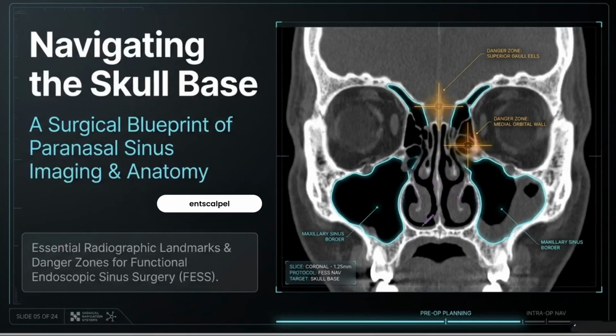Precisely. It's not about the destination of the image. It's about dictating the physical path of the radiation to ensure absolute consistency. Because if that beam is off by even a few degrees, the shadows overlap completely differently, right? Exactly. A shadow might obscure a real pathology, or honestly worse, it might create a false shadow that a doctor then misdiagnoses as a tumor or a fracture. Man, that is incredibly high stakes.